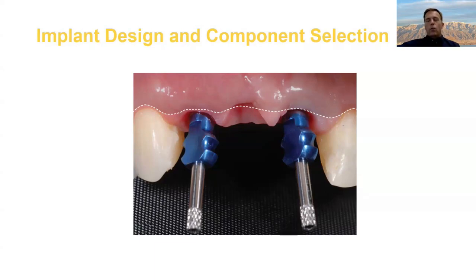I like to always start with the surgical report. If restorative doctors ask me about this, I ask them to get the report from the surgeon, because a lot of times it has the sticker right from the implant vial that says all the vital statistics on the implant.